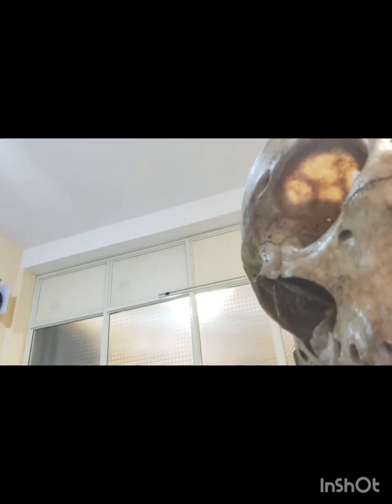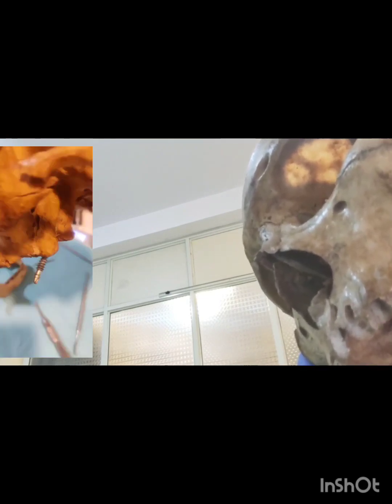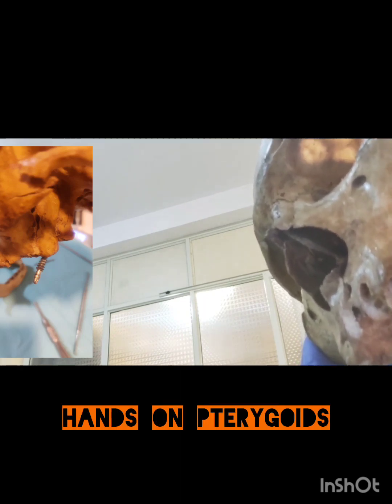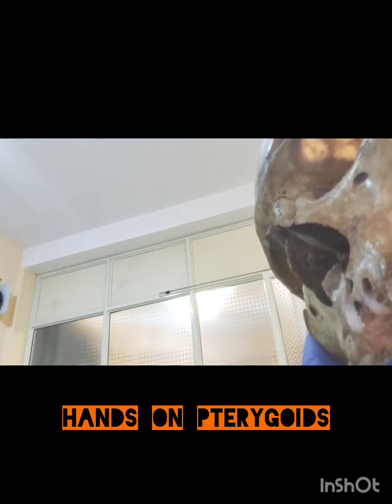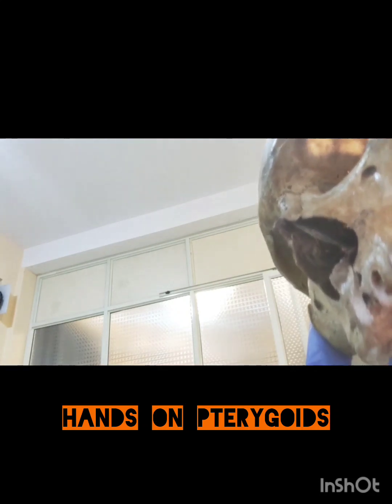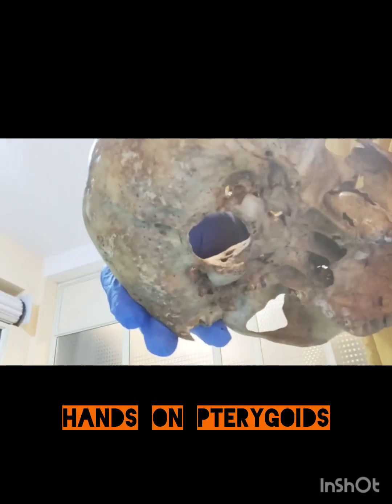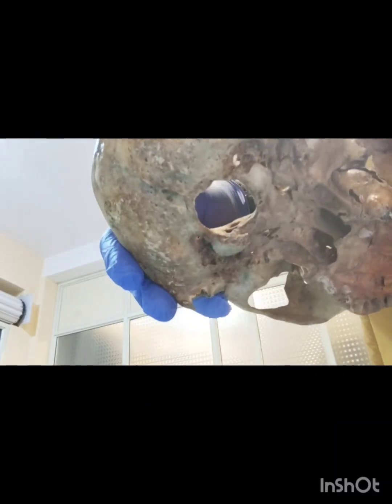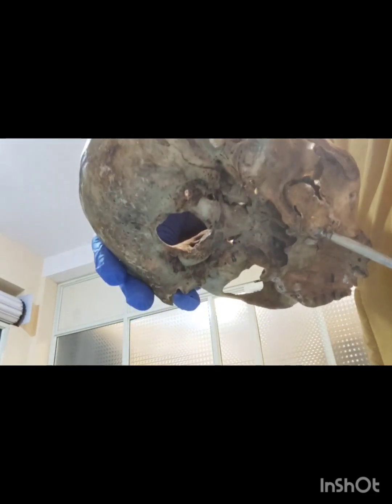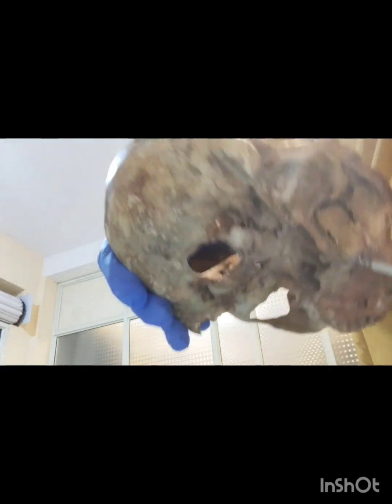So in this region, to engage into the pterygoid plate, if the angulation and osteotomy technique is perfect, you can engage up to 26-30 mm also. So beyond that, if it is above 35 mm, it's difficult because of the presence of the maxillary artery, the branch of vessels. Many doctors will complain that there's no need to place double pterygoids. You do have complications. You will not have any complications if you can do the osteotomy properly and follow the rules.